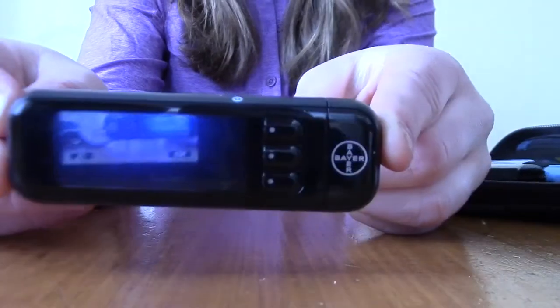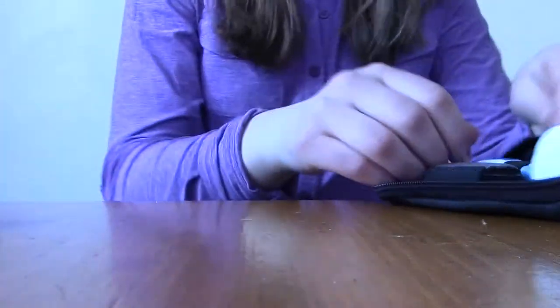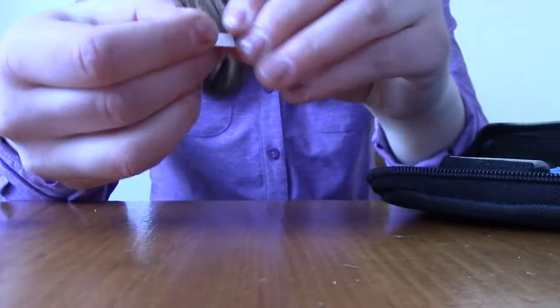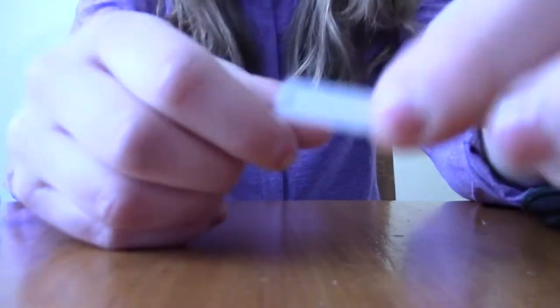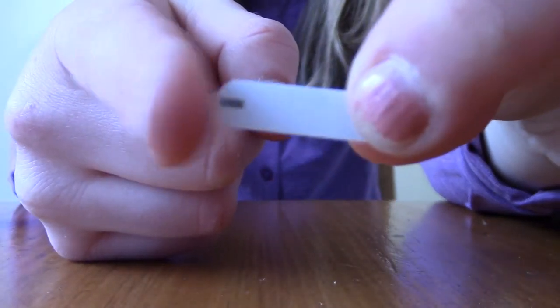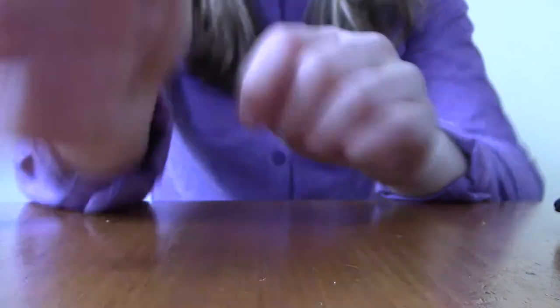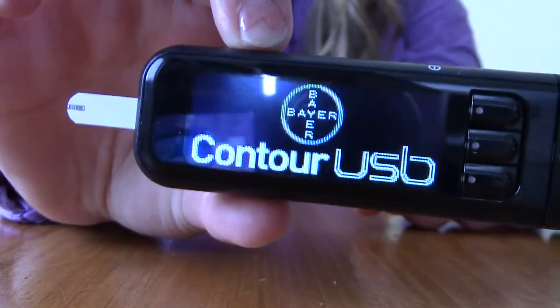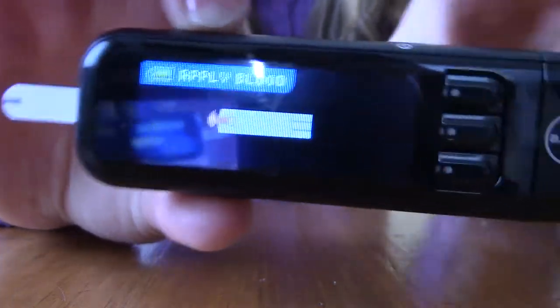Excuse me, I'm just getting over a cold. Alright, then you need to get your blood glucose strip. This is the strip where you're going to insert your blood—your blood will go on this end right here, and then this part will go into your meter, which is what tells you your reading. You insert it like this, the meter turns on, and then it should tell you to apply your blood. I don't know if you can see what that says, but it says 'apply blood.'